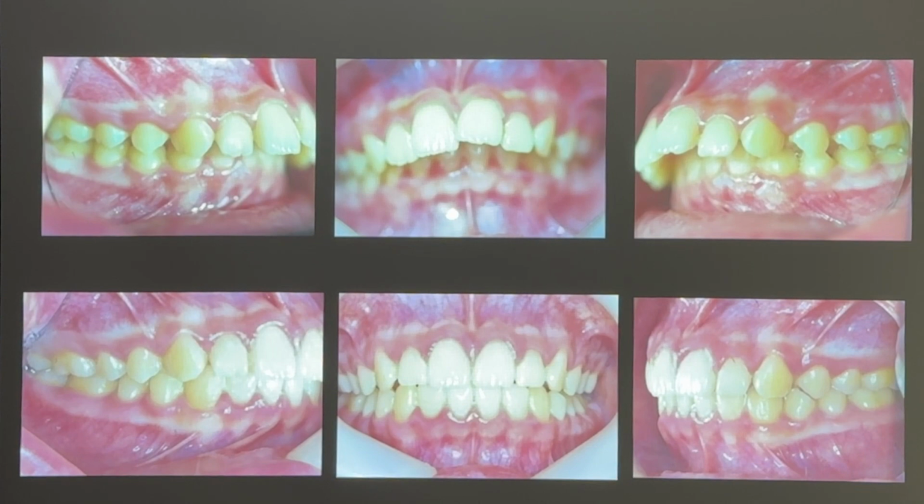It means the procedure of attaching the tape is a brain attack, a brainwash of the patient. When the parent cuts the brown tape a little bit and attaches it here, the patient thinks, oh, if I keep my mouth open, it makes bad facial appearance and bad occlusion.